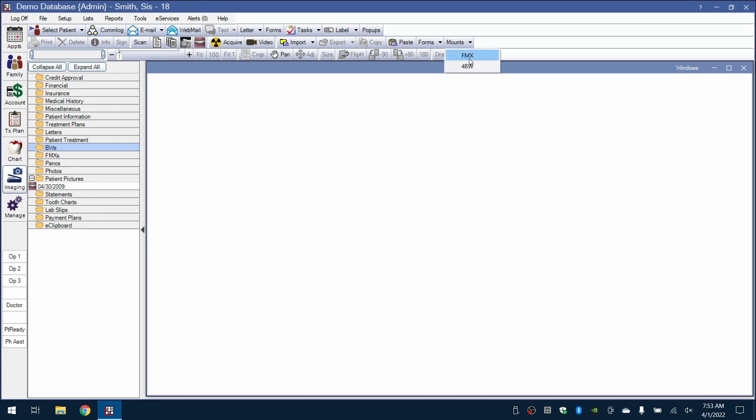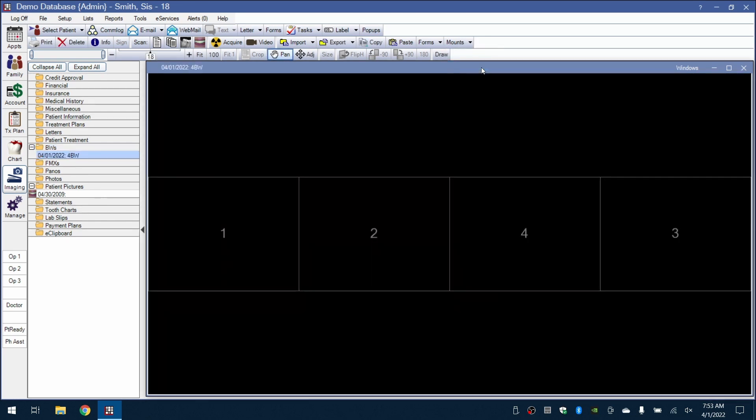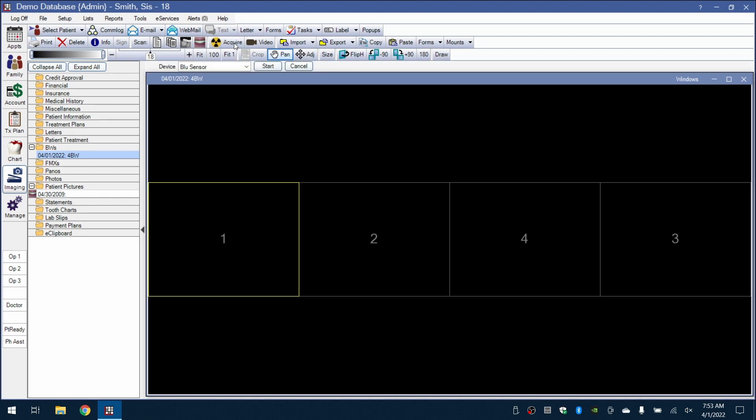We'll go up to Mounts and pick the four-bite-wing series. We'll then select where we would like to start, so the first square. Clicking on the Acquire button will then prompt us to select our device and then click Start when ready.